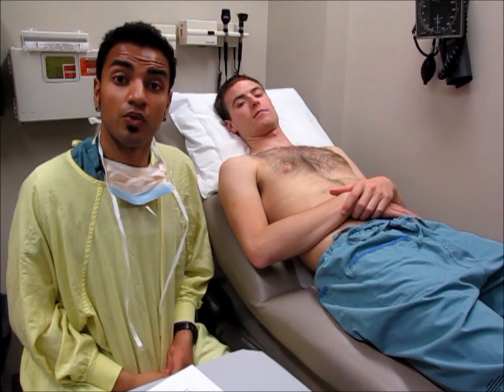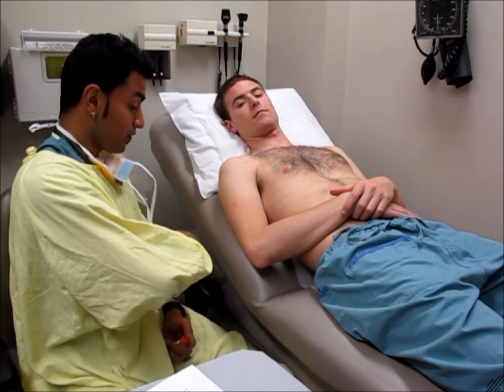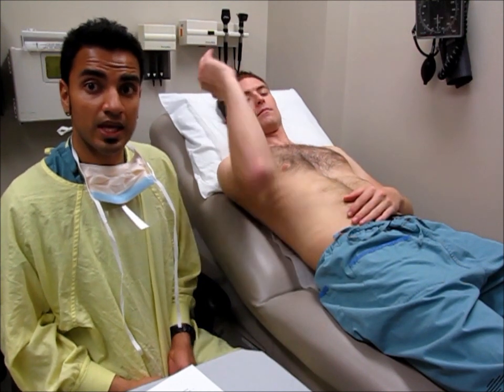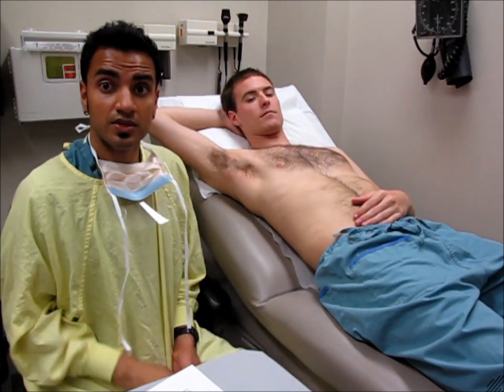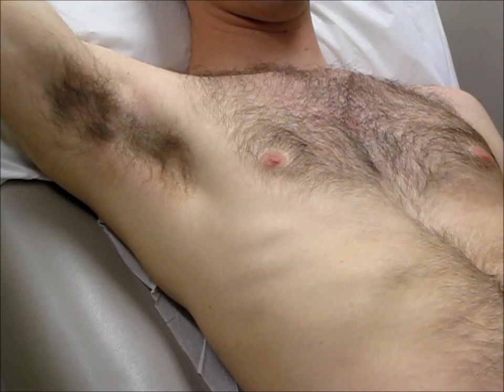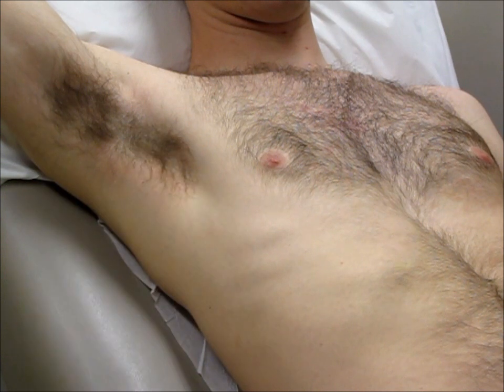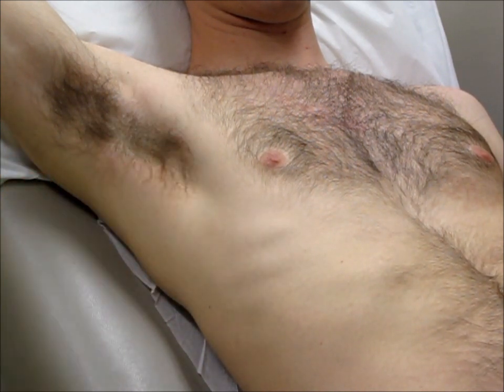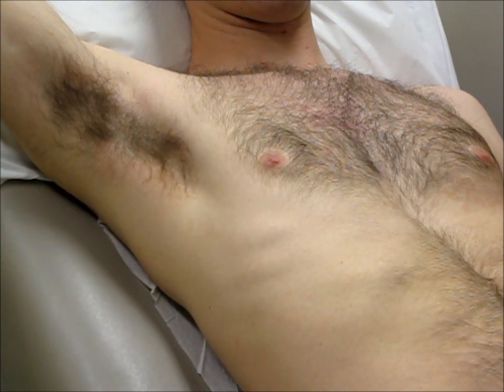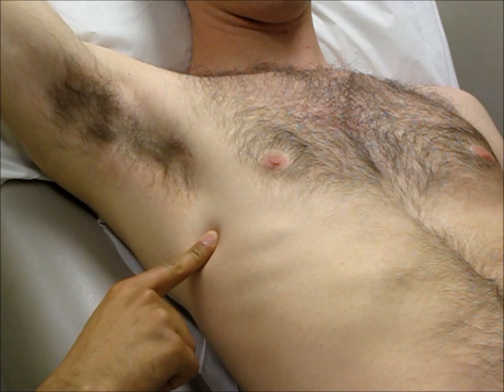Once all the relevant supplies have been found, you are now ready to insert your chest tube. First, you must position the patient appropriately, either fully supine or at an angle for comfort. Next, the ipsilateral arm must be fully abducted behind the head, which provides significant and full exposure to the area — though in a trauma setting, full exposure may be limited. Next, the location of the chest tube must be chosen. Generally, clinicians choose the mid to anterior axillary line at approximately the fourth and fifth intercostal space. This site can be approximated using the nipple line in men and the inframammary crease in women, and is chosen as there is minimal underlying musculature and the risk of damaging adjacent organs is least.